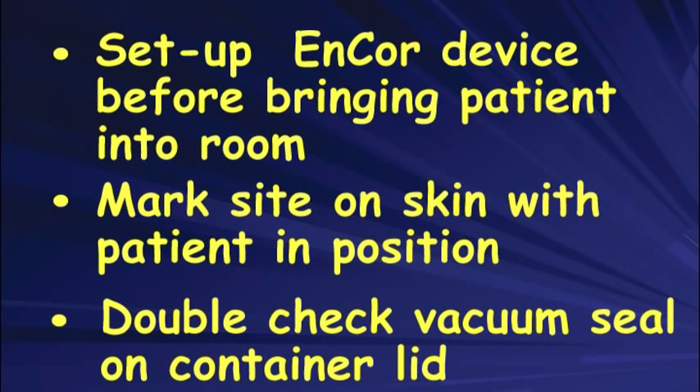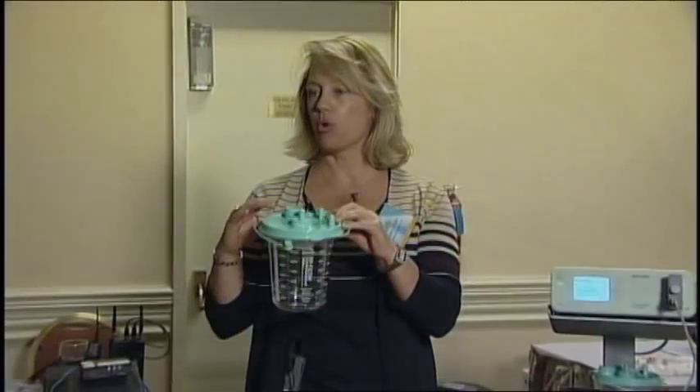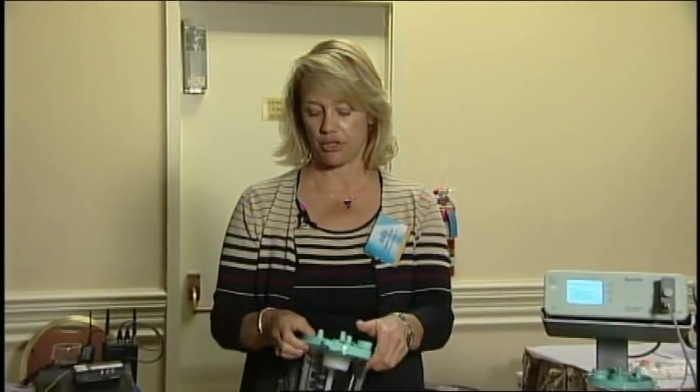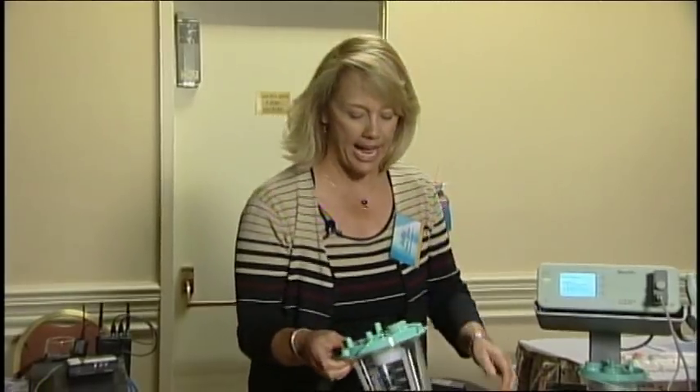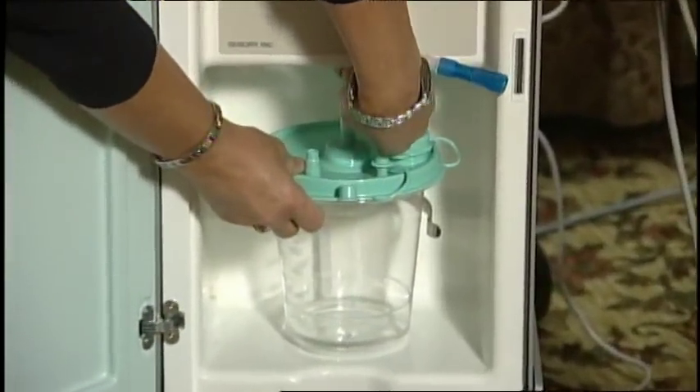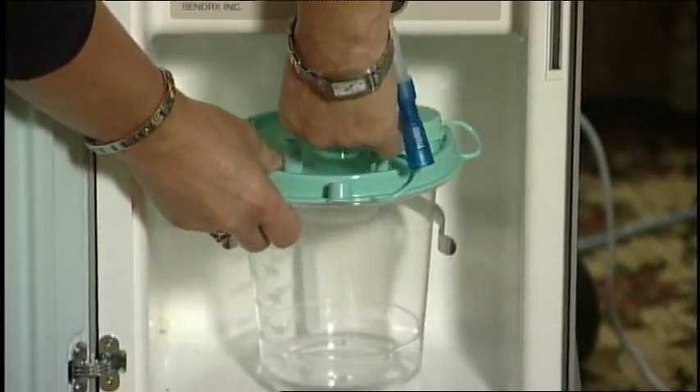We go ahead and set the T-tubes in. In Denver — mile high — we tend to have some issues with vacuum, but with all these tips you shouldn't have any problems here in California. One thing that's really important: make sure this lid is sealed very securely on the canister and all your caps are capped securely. I'm going to hook this up here.